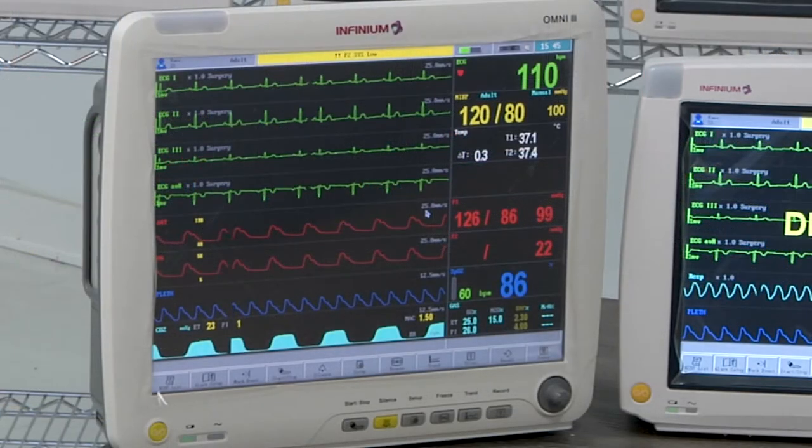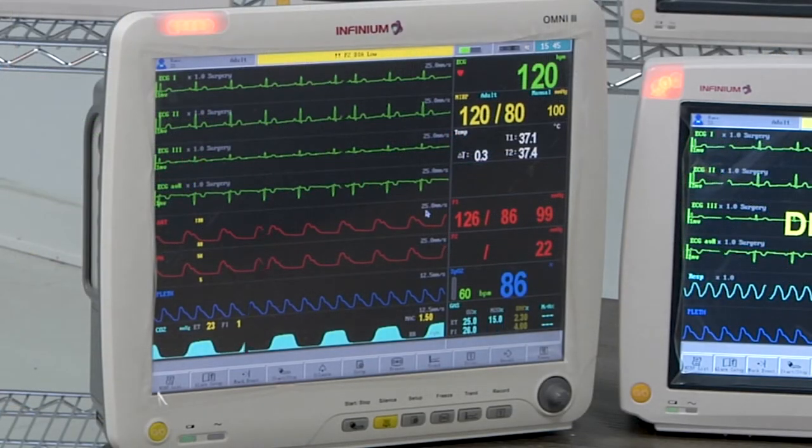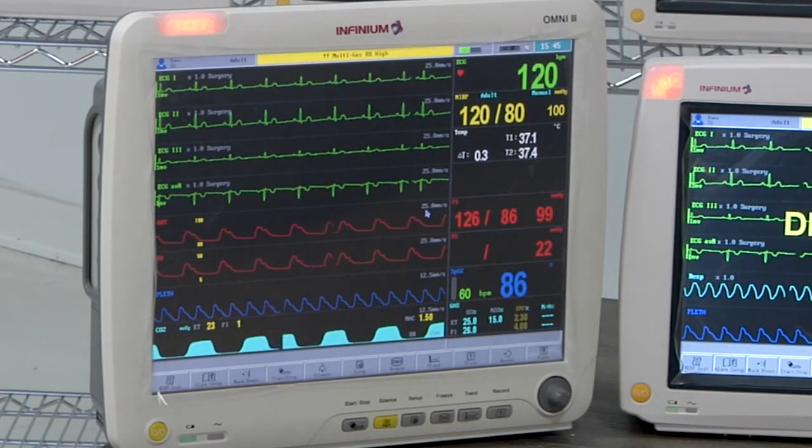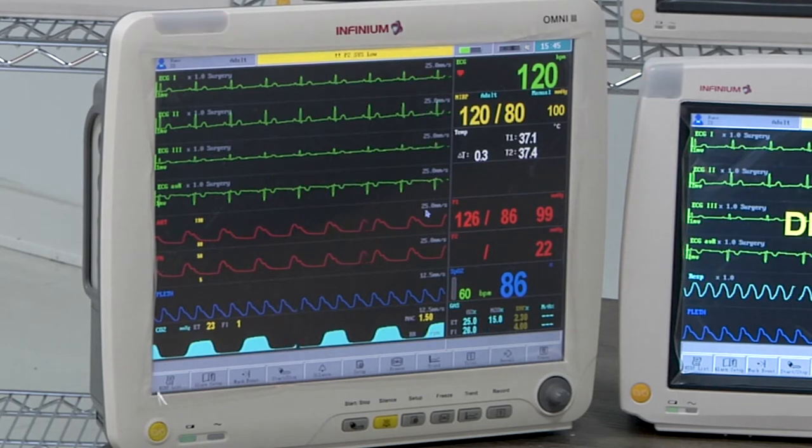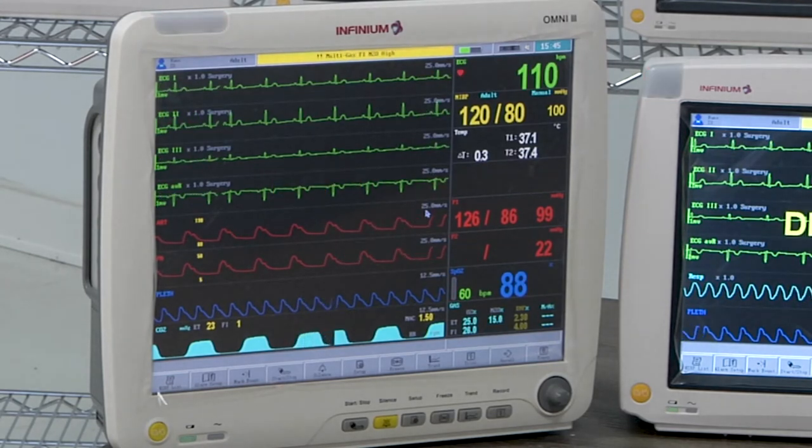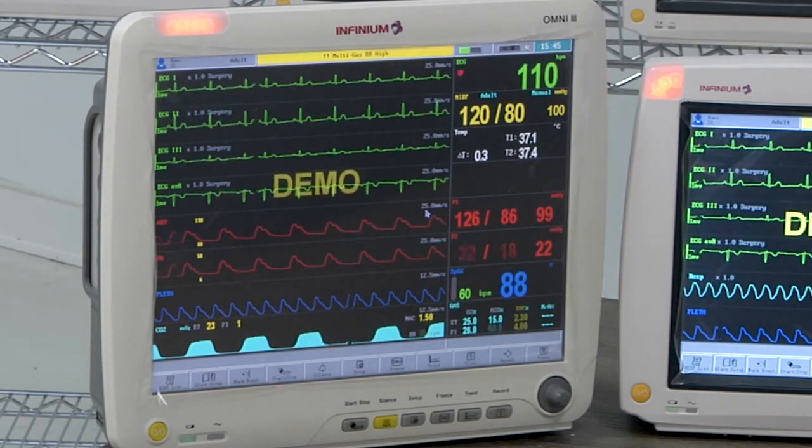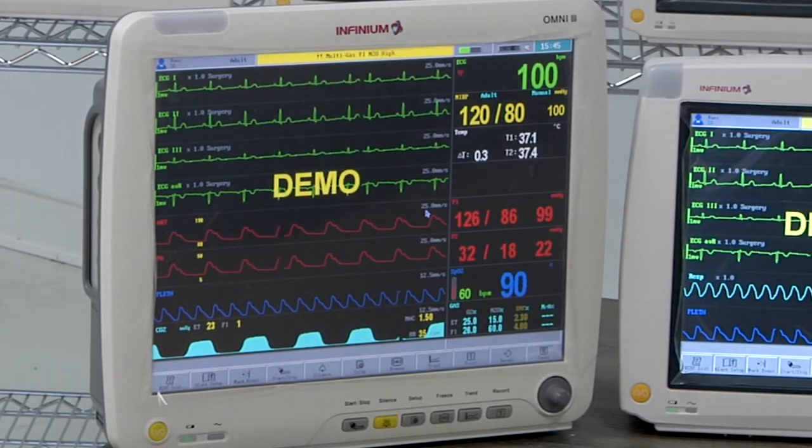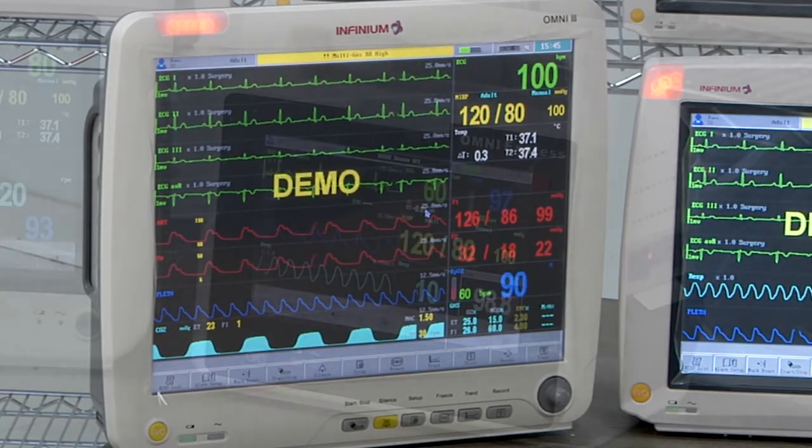The 15 inch Omni 3 monitor has additional optional functions including cardiac output, BIS, and internal anesthetic gas module for anesthetic agent monitoring.